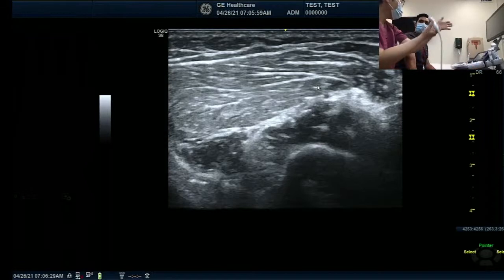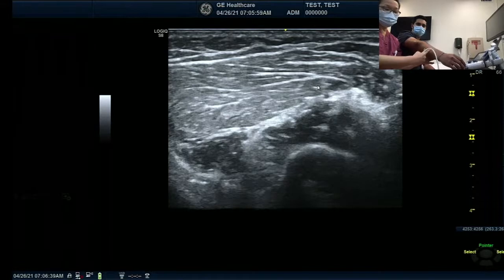Otherwise, it stays in between the muscle. And then later, when it comes this much, do you guys see it? The radial styloid process is about 9 centimeters from this part. The superficial nerve branch comes out to the skin surface area. It goes to the anatomical snuffbox, and this supplies digits 1, 2, 3.5. Right? So now we're clear.